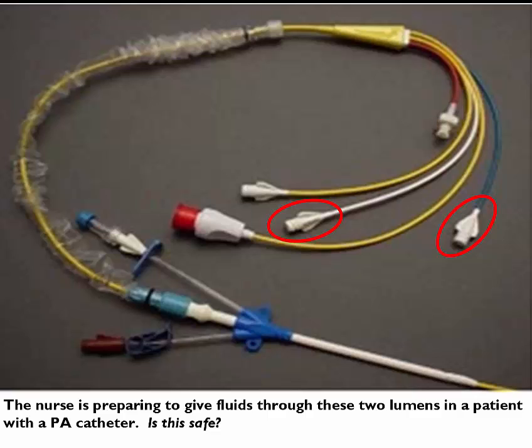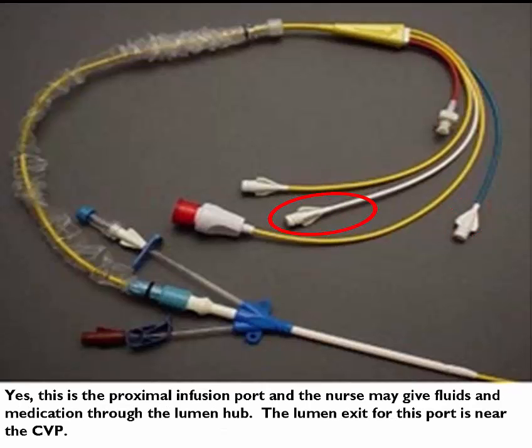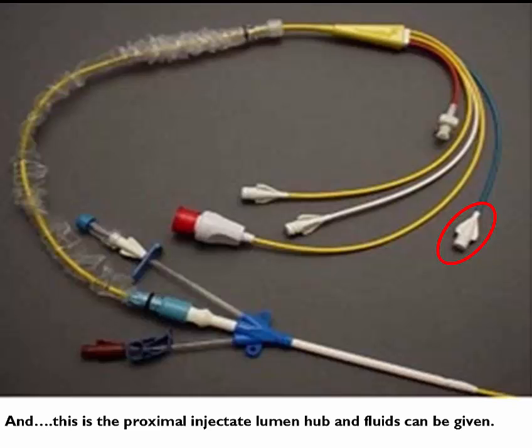The nurse is preparing to give fluids through these two lumens in a patient with a PA catheter. Is this safe? Yes, this is the proximal infusion port, and the nurse may give fluids and medication through the lumen hub. The lumen exit for this port is near the CVP. And this is the proximal injectate lumen hub, and fluids can be given.